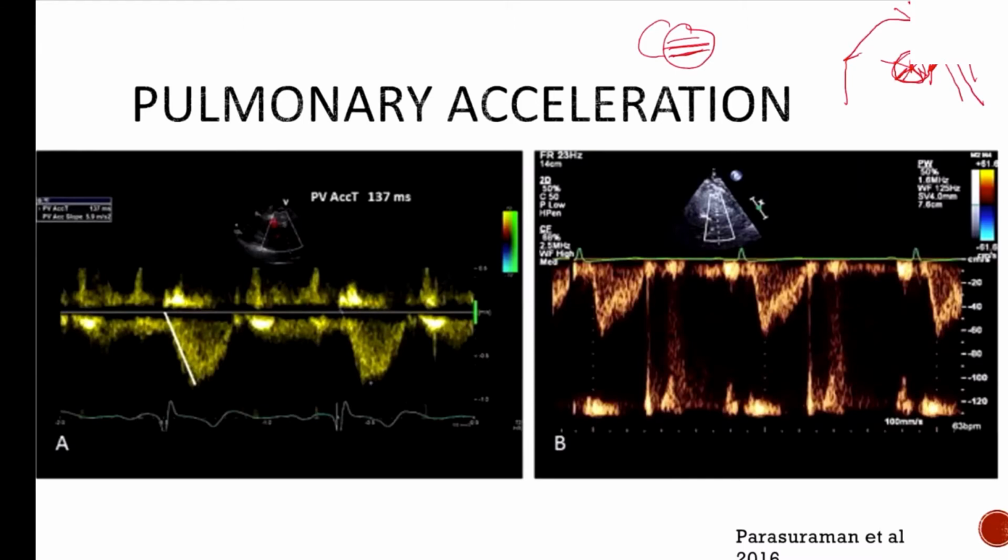Okay. So is this blood here moving away or towards the probe? It's moving away. So we're watching the blood flow leave your right ventricular outflow tract. The normal shape of your flow out of the pulmonic outflow tract is going to be relatively symmetric, so it's going to look like a regular triangle. If the pressure is very high in the pulmonary artery, then very rapidly you're going to have equilibration. Very quickly this flow stops. It goes in very quickly with high pressure, but you have a high pressure back in the pulmonary artery, and therefore all of a sudden that flow is going to stop because those two chambers equilibrated.